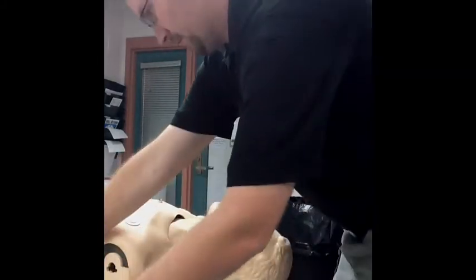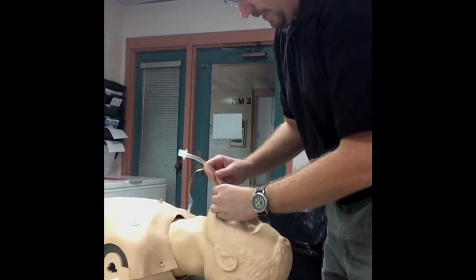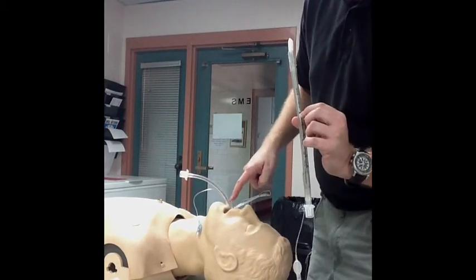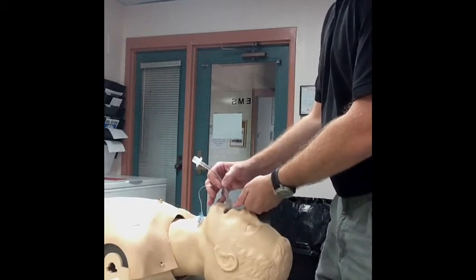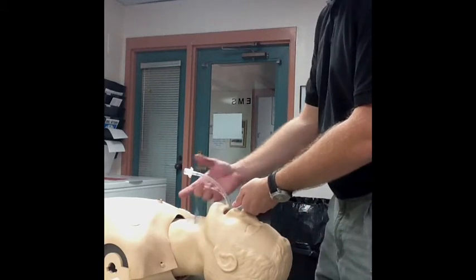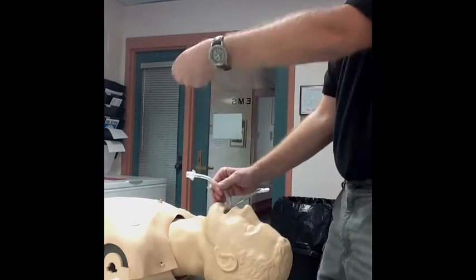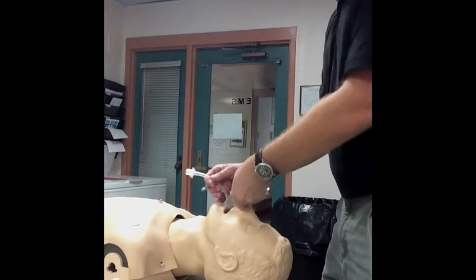To do that, I'll take my endotracheal tube, apply a little lubricant, and insert it. There will be a marker on the tube, and when that marker lines up with the proximal tip of the LMA, I stop inserting. Then I place my hand on the handle of the LMA Fast Track and perform what's called Chandy's Maneuver, named after an anesthetist by the name of Chandy. This significantly improves the chance of first pass success. I perform an upward lifting motion, similar to what I'd do with a laryngoscope — not rocking, just pulling up.